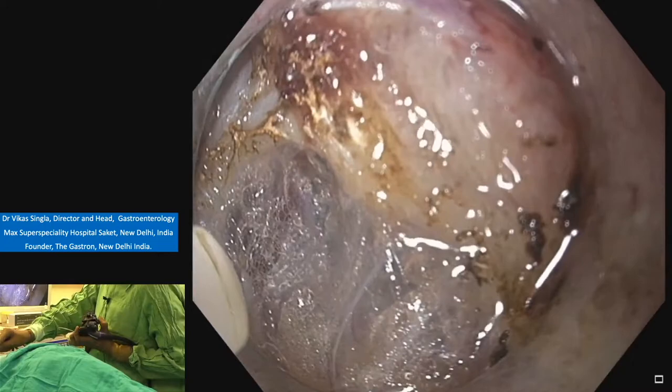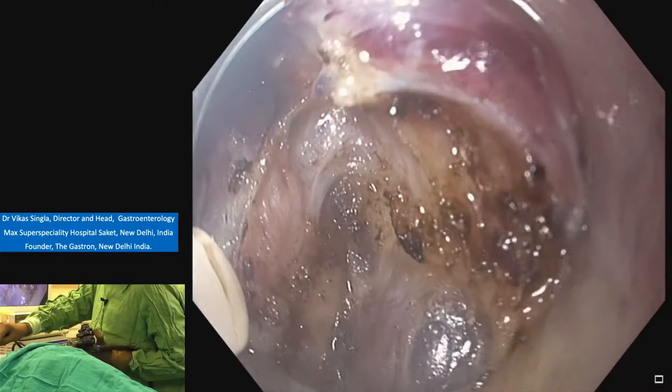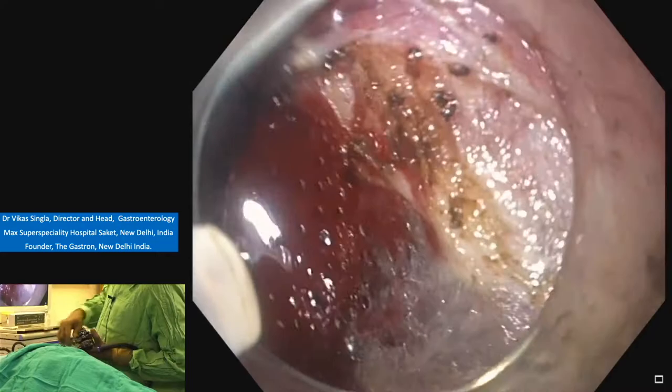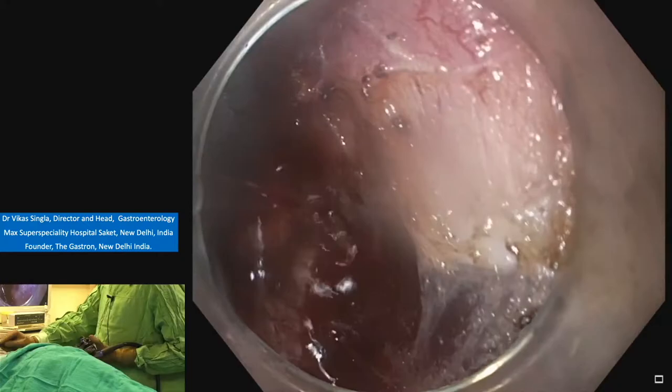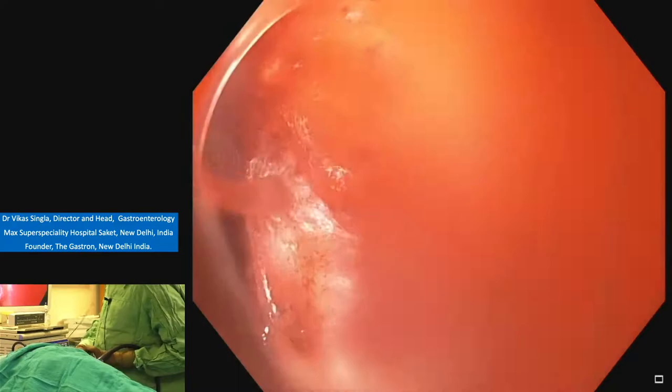Again, careful cutting. So this is the last part, and we can see that we are directed more towards the left curve. Oh, some bleed there. So nothing to panic. Even if there is a bleed, one should complete the cut. Otherwise, the vessel will disappear. So whenever you're doing the myotomy and the bleed occurs, don't panic and complete that cut.